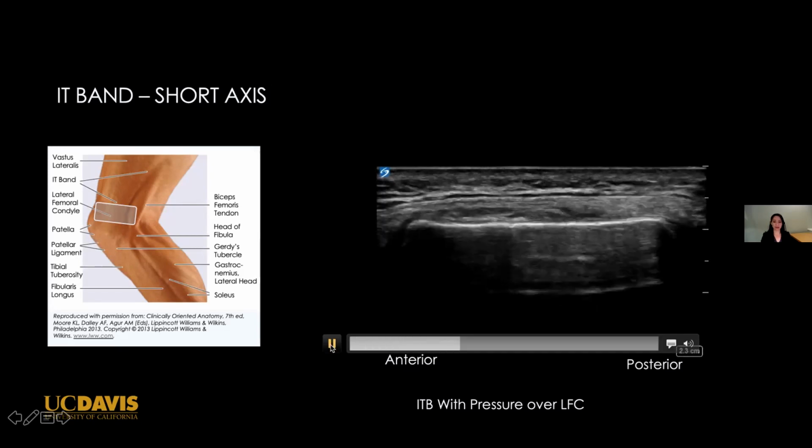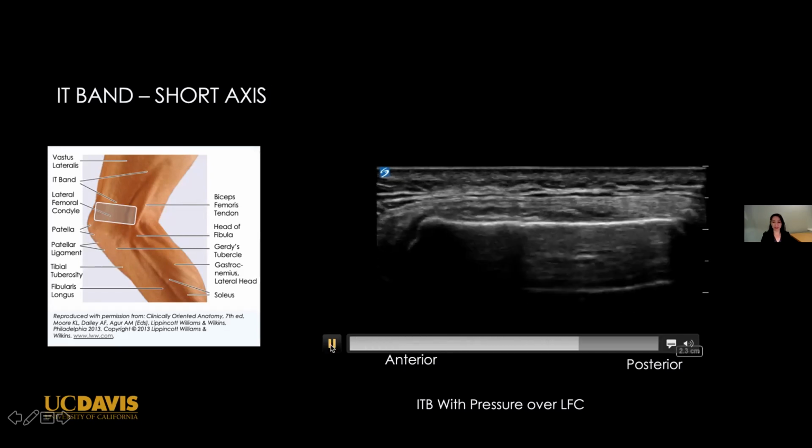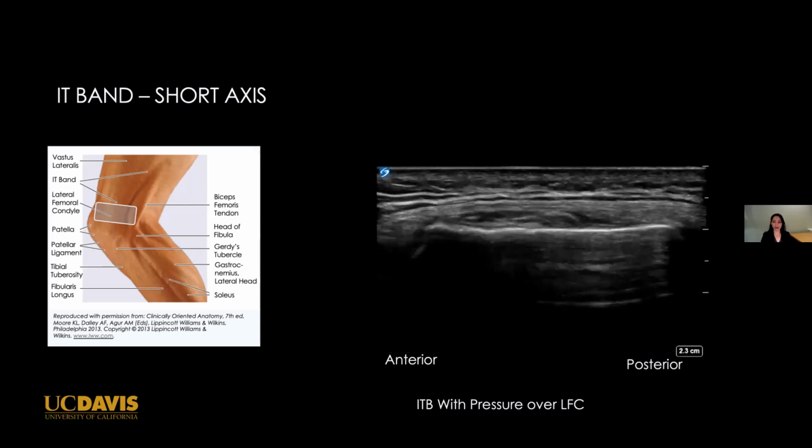One is the lateral parapatellar recess of the knee joint, which can be seen overlying the femur and connects intra-articularly. This patient, for reference, had a trace effusion on ultrasound. And literature reviews how the synovium can fold into the lateral recess and appear to be IT band bursopathy. And then secondly, the IT band bursa is just deep to the IT band and is likely pathologic and related to IT band syndrome.